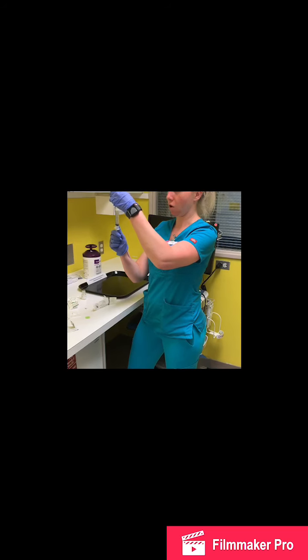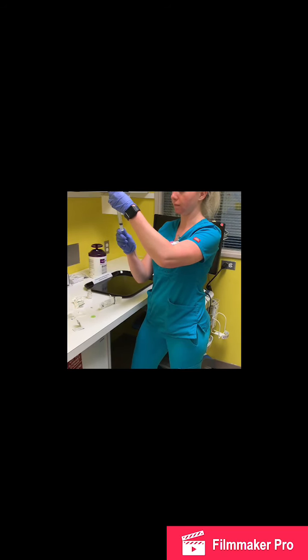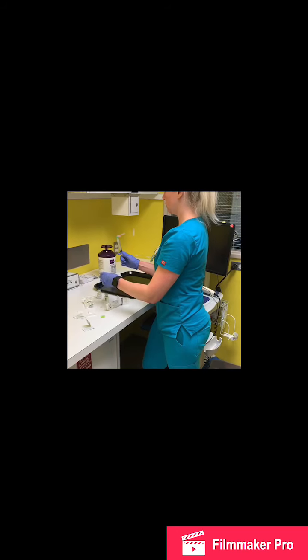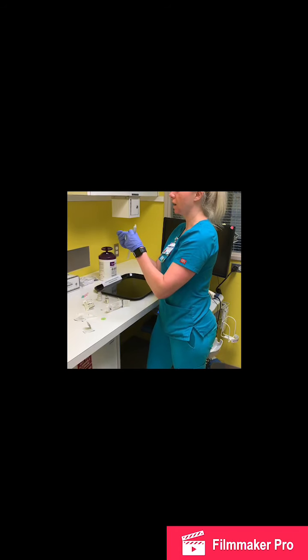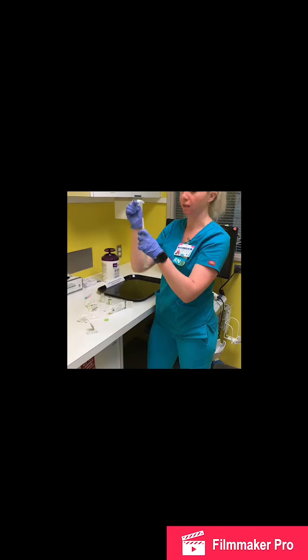Making sure I get all the medication out and I have my full 10 cc's in my syringe. I'll then remove my needle. I'm going to put the safety cap on, take it off, and then I'm going to put my blunt end cannula on there so that I can sterilely and safely transport it into the patient's room.